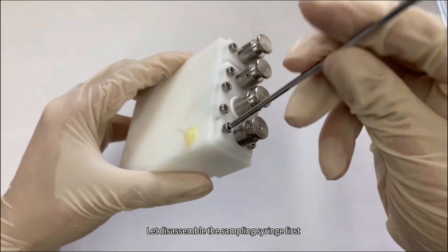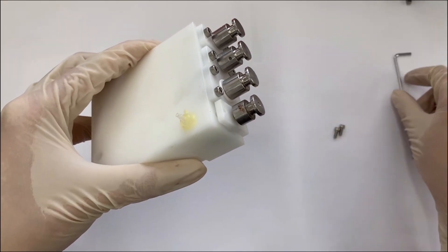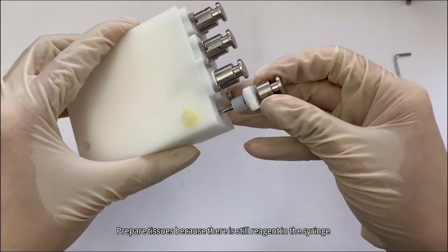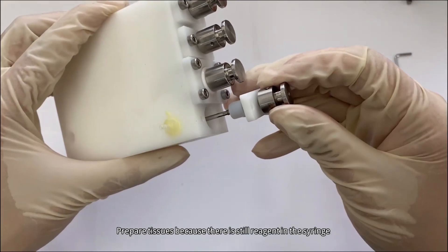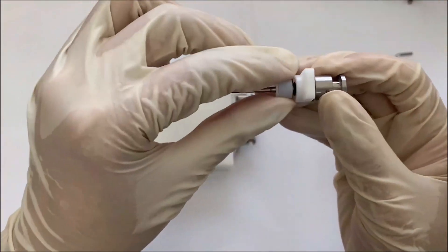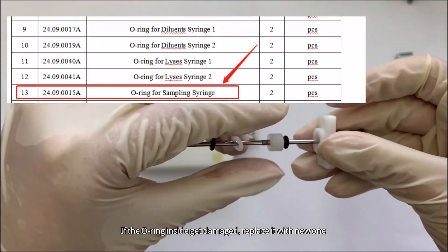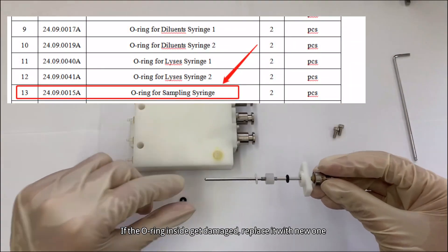Let's disassemble the sampling syringe first. Prepare tissues because there is still reagent in the syringe. If the O-ring inside gets damaged, replace it with a new one.